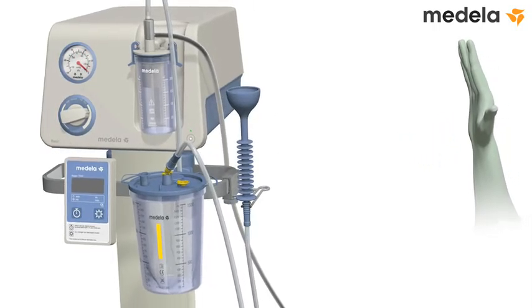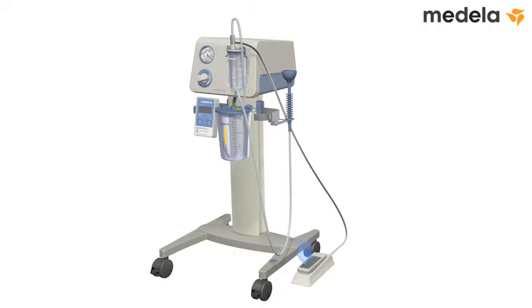Return the foot-controlled vacuum regulator to its resting, zero-pressure state by pressing the back part down using the heel of your foot. The equipment is now ready for use in the vacuum-assisted delivery procedure.